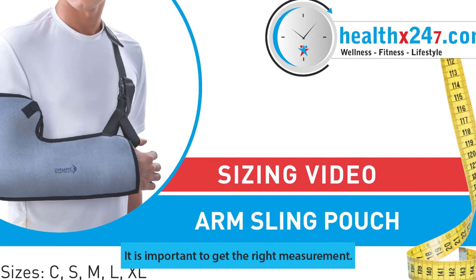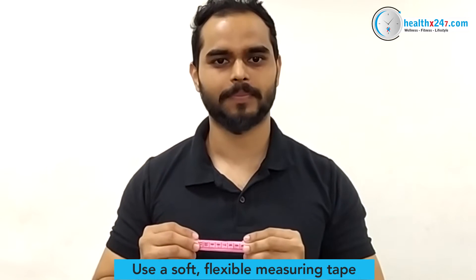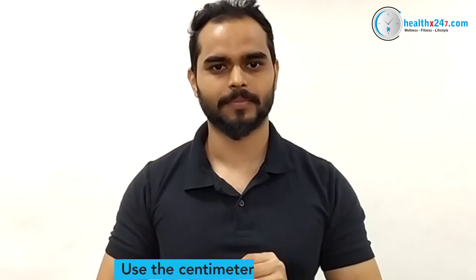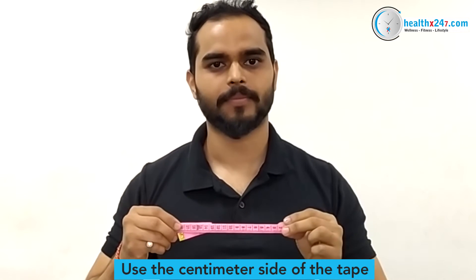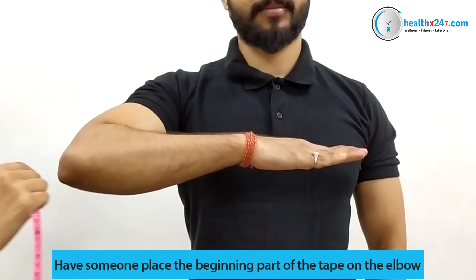It is important to get the right measurement. This video guide will help you select the correct size. Number one: take a measuring tape. Be sure to use the centimeter side of the tape. Have someone place the beginning part of the measuring tape on the elbow.